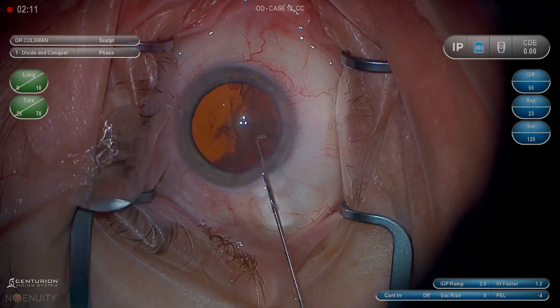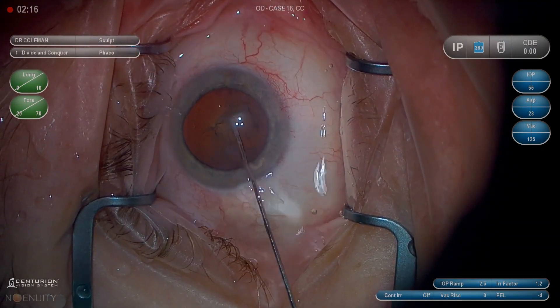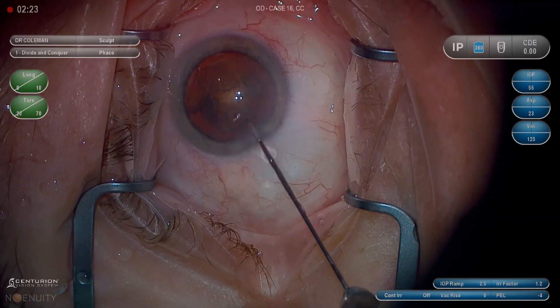You'll see a pulse here — I'm having a little trouble getting the fluid wave to come across. I'm pulsing, and that last pulse got it. I think getting lifted up a little more on the anterior capsule leaflet gave us the space for that fluid wave to come around.